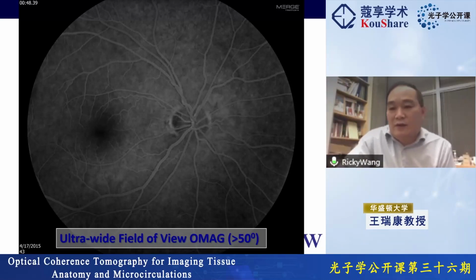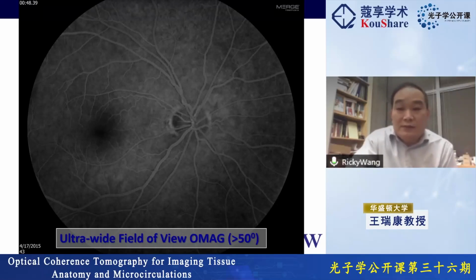Okay, and this is, of course, the invasive approach. It will cause harm to people. Okay, and so this is the gold standard. However, in this gold standard FA image, you only see the big blood vessels. Okay, and the smaller blood vessels, for example, capillaries, you do not see them well.